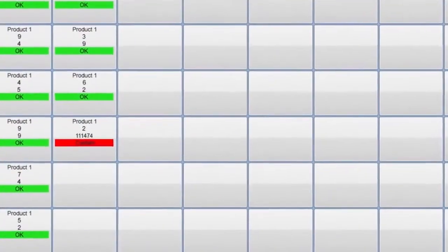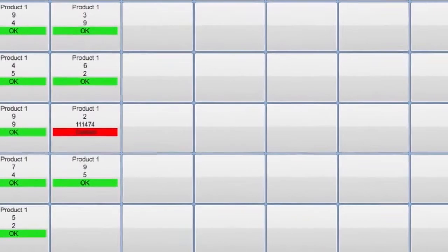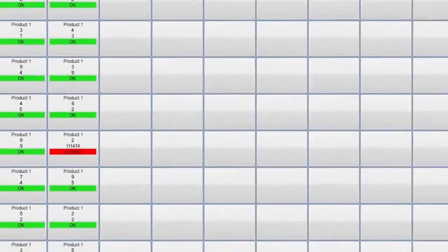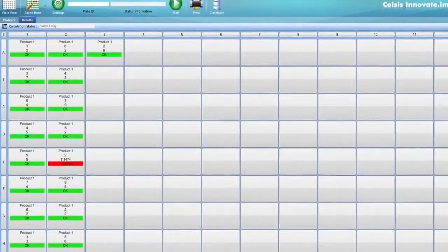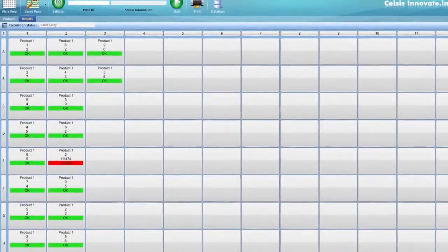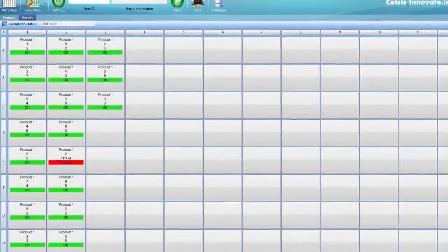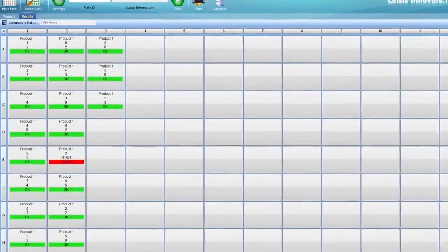Positive results are highlighted in red, based on predetermined levels that are established during product validation. All the samples that test negative for microbial contamination are highlighted in green. These can be released immediately.